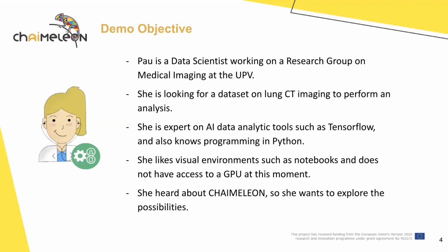So we have a researcher, Pau, who is a data scientist working in a medical imaging research group at the Polytechnic University of Valencia. She's looking for a dataset on lung CT imaging to perform an analysis. She's an expert on AI data analytic tools such as TensorFlow and knows how to program in Python. She likes visual environments such as notebooks and does not have access to a GPU at this moment. So she heard about CHAIMELEON, and she wants to explore the possibilities.